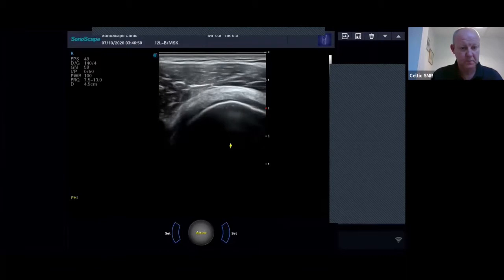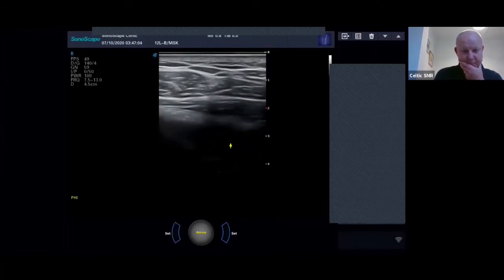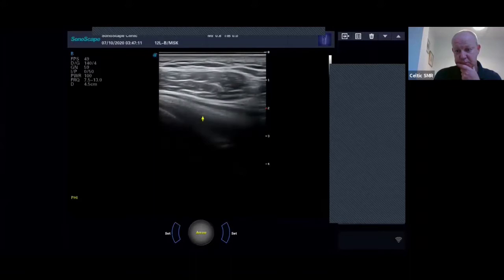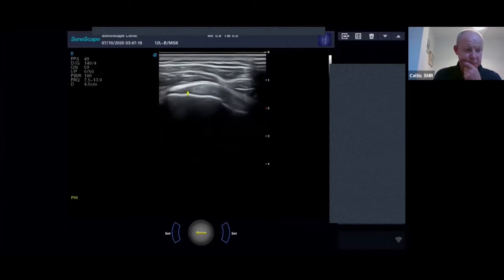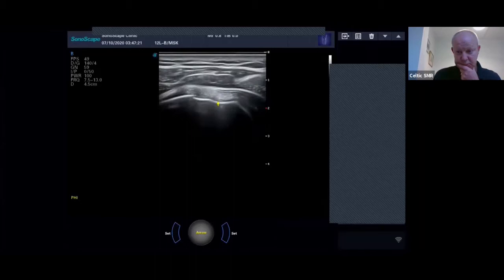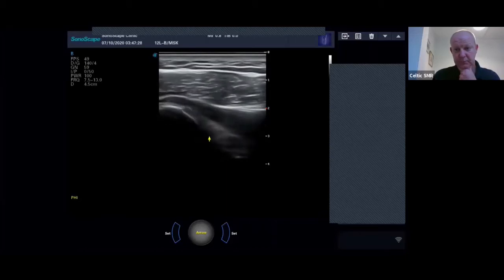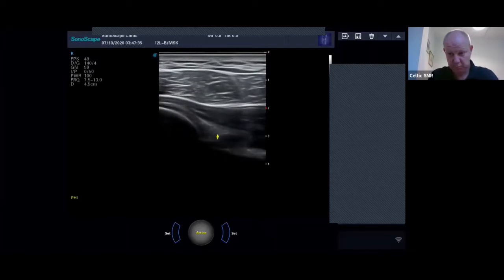Okay. So once I've done that, that's supraspinatus there, then I go on to infraspinatus. If you pop your arm across onto your shoulder. And then what I tend to do is go back, pick up this, where's the arrow gone? There it is. Pick up this bright band here, that's your central tendon. Around, and I just follow that round onto the insertion here. Come back and back, and then I just take my probe down inferiorly, and I come onto the glenohumeral joint. So we've got the labrum, glenoid.